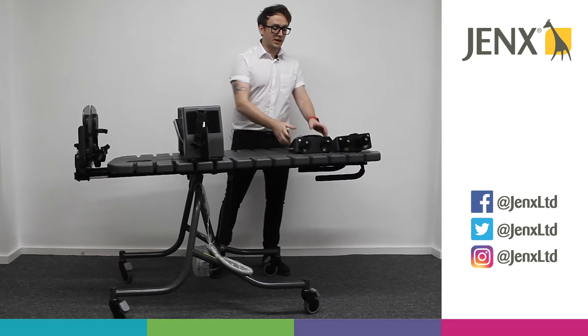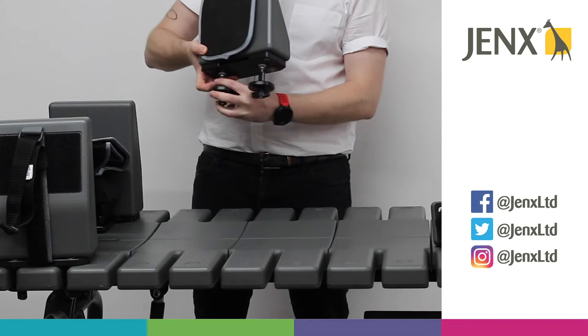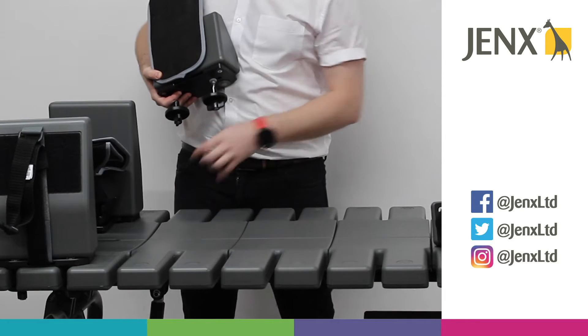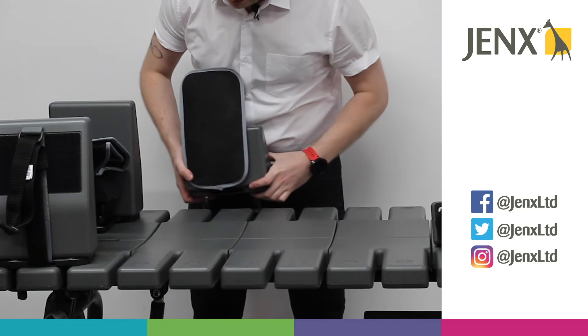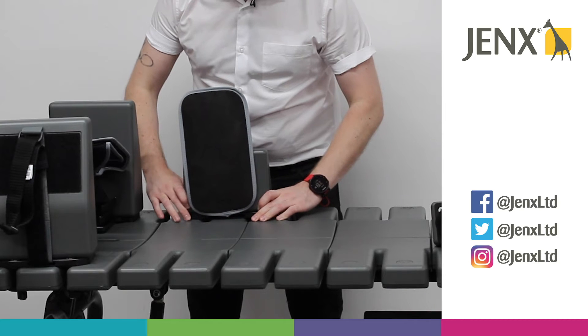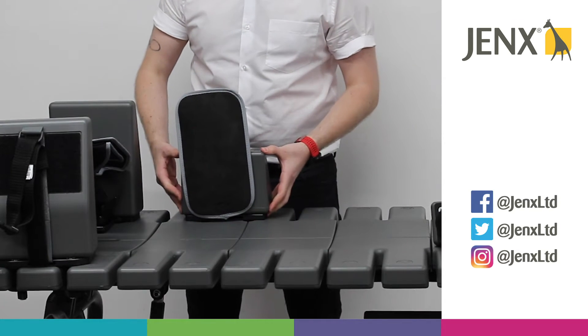We're going to look at the hip control pads. We've got our two columns at the bottom of the pad and we've got the grooves within the boards. Once we've located the grooves that we want, we can pop the hip pad into the correct position.